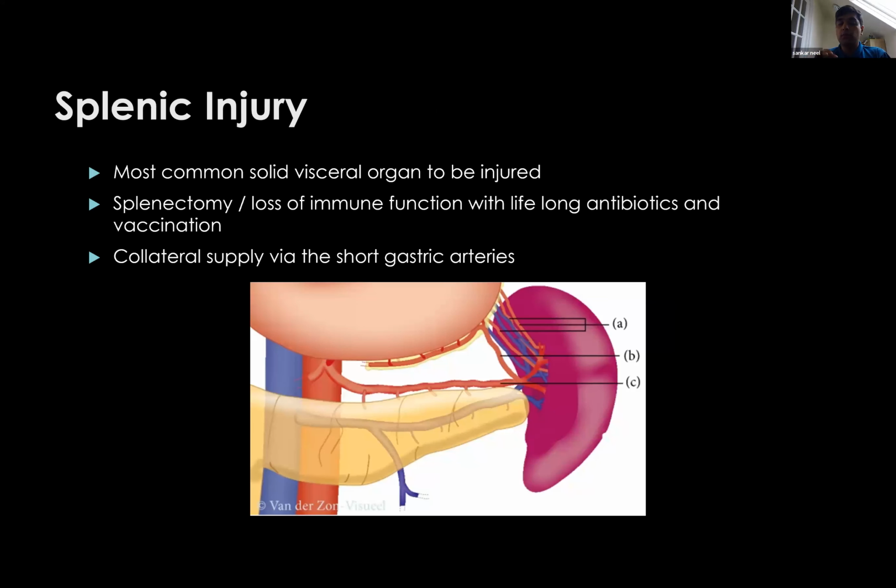Right. Now let's move on to splenic injuries, which is the most common organ to be injured. There are 2 concepts of splenic embolization that are important to understand. The first is proximal embolization, which means you embolize the splenic artery at that point. Now, if you embolize it proximally, before the hilar bifurcation of the splenic artery, the spleen is still supplied by collaterals.